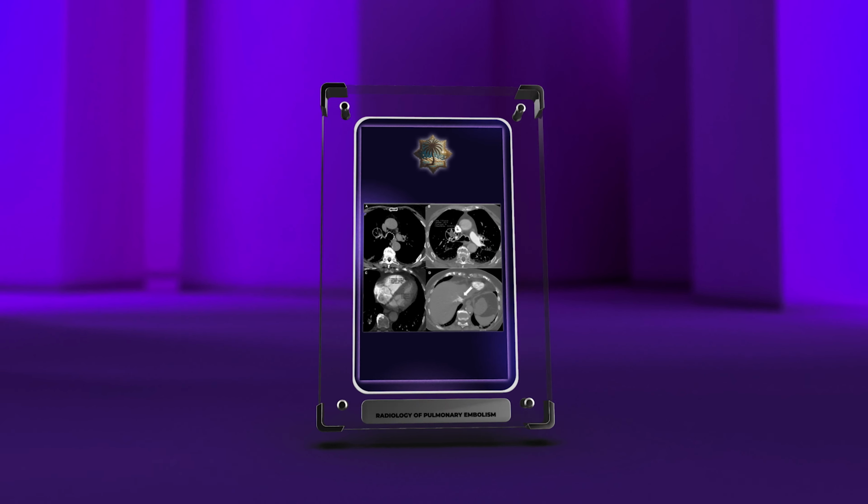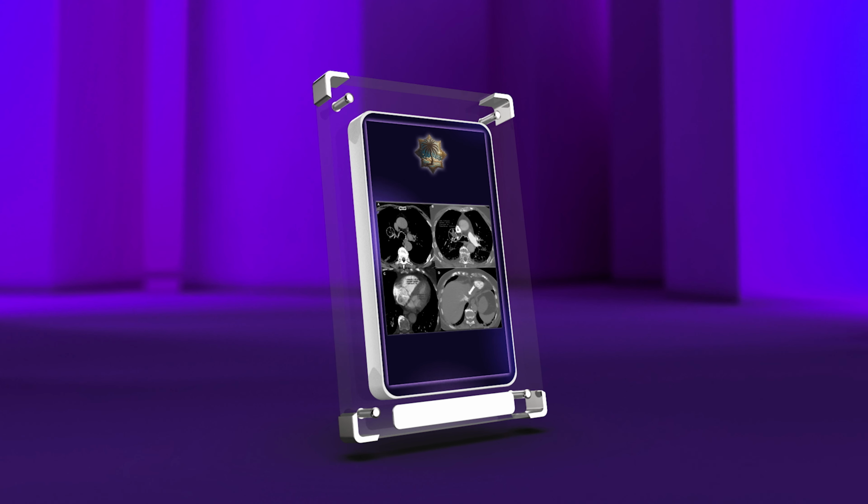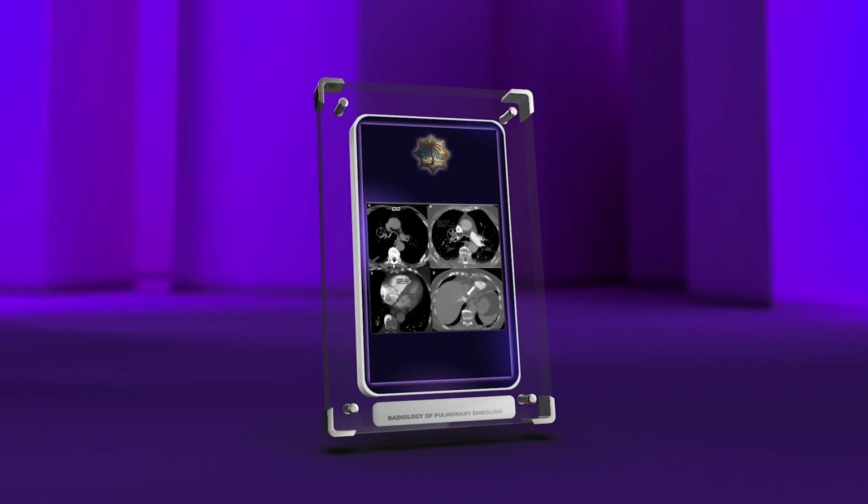In conclusion, pulmonary embolism diagnosis and treatment rely on the continuous advancements in radiology. By employing a multidisciplinary approach, radiologists play a crucial role in detecting, assessing risk, and monitoring treatment progress. We hope this video has expanded your understanding of this critical field.